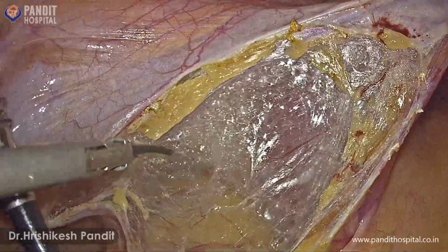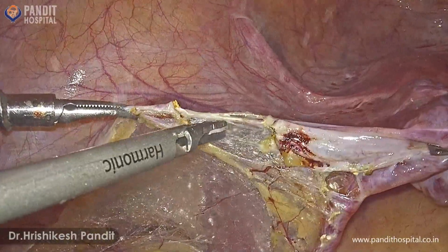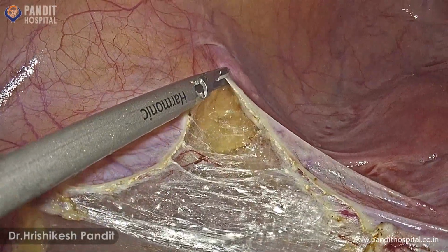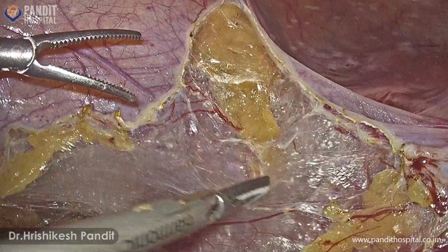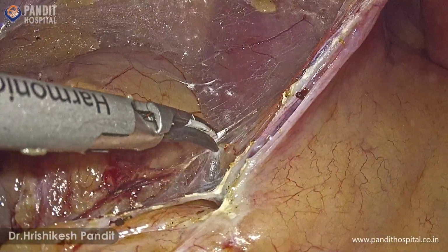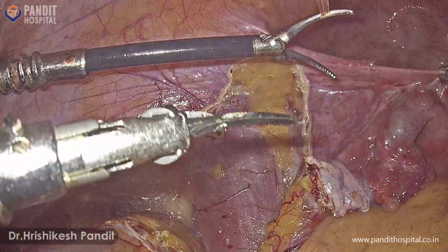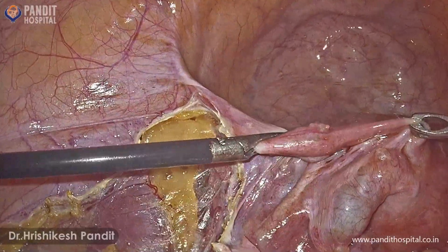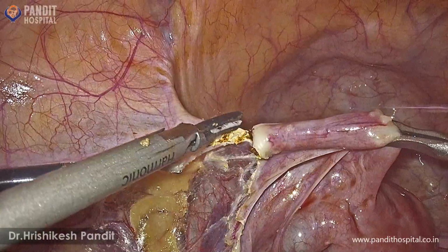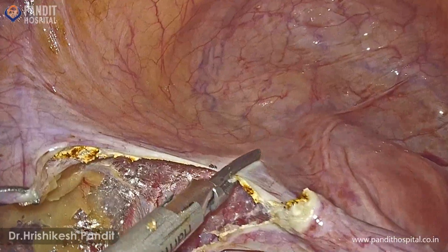We have inserted two side ports on the left side for the surgeon and one right-sided port for the assistant. Kindly make a note that we have put Schauter's stitch, that is, a stitch is put vaginally over the tumor so as to avoid the tumor cells from spilling into the peritoneum when the vault is being opened. Following oncological principles, no uterine manipulator or myoma screw is being used for this case.